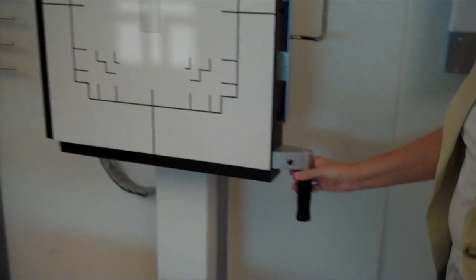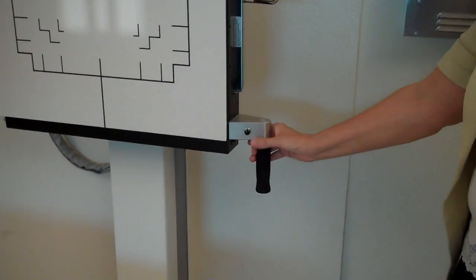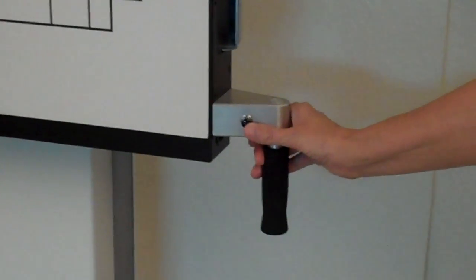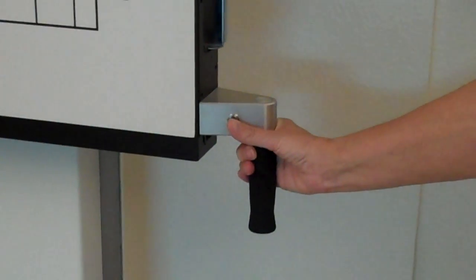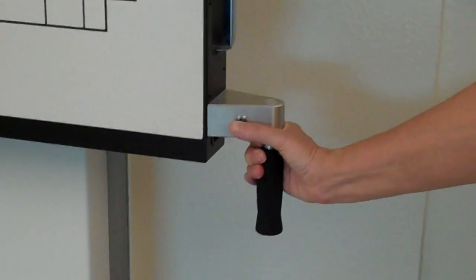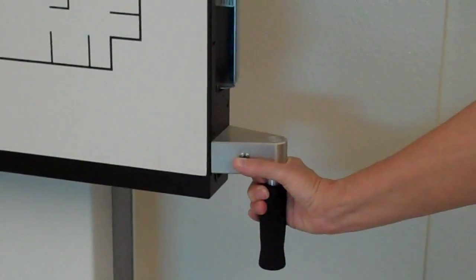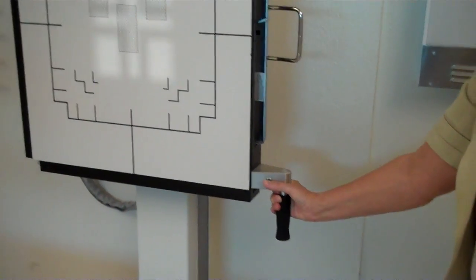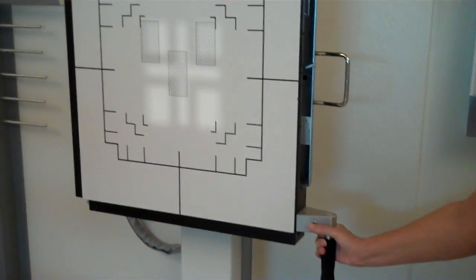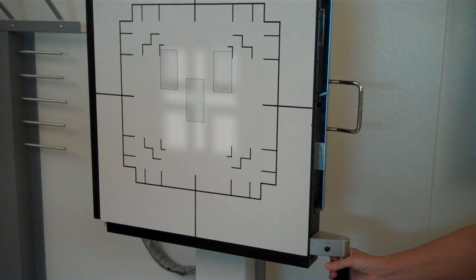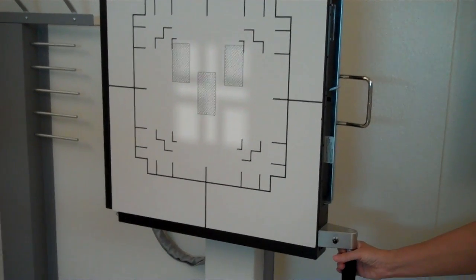The bucky will move up and down with an electronic release at the base on the handle. Be careful if there is an image receptor in the bucky. It may be heavy.